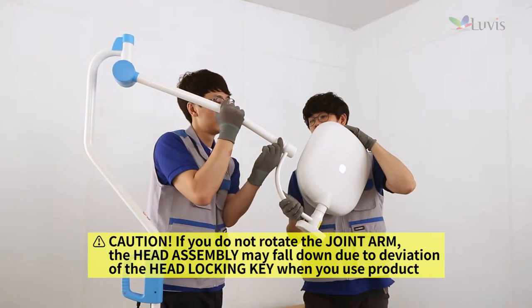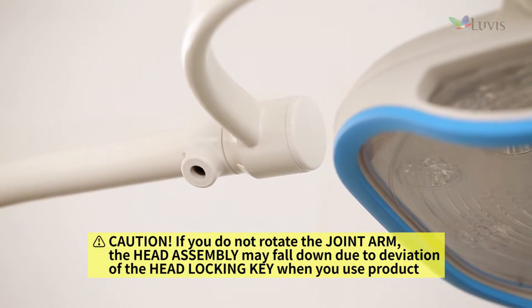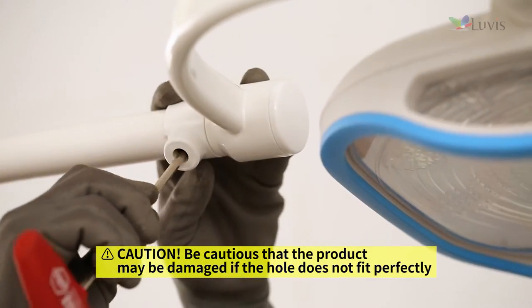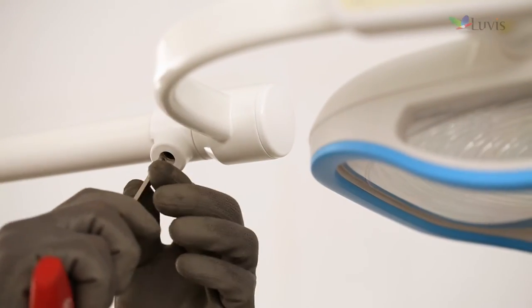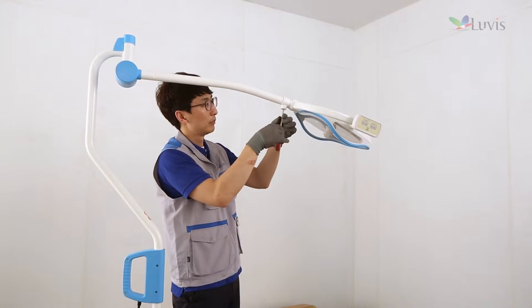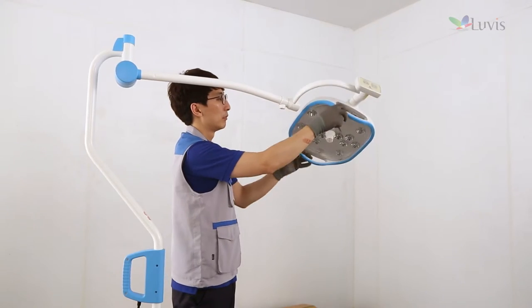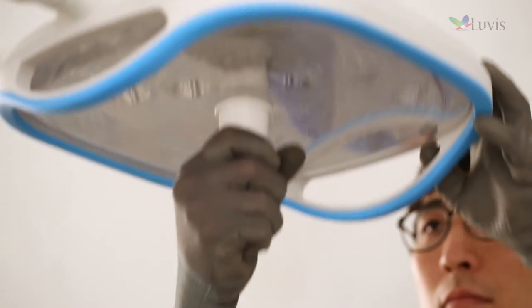Hold the joint arm and rotate the prominent part to make it face down as shown on the screen. After aligning the hole, tighten the joint arm bolt gradually with the M5 wrench and adjust the right and left tension of the head assembly. Adjust the rotational tension smoothly while tightening the joint arm bolt gradually. If the head assembly slips without being fixed, tighten the joint arm bolt further using the M3 wrench. Adjust the head knob and install it in the locking key hole as shown on the screen.